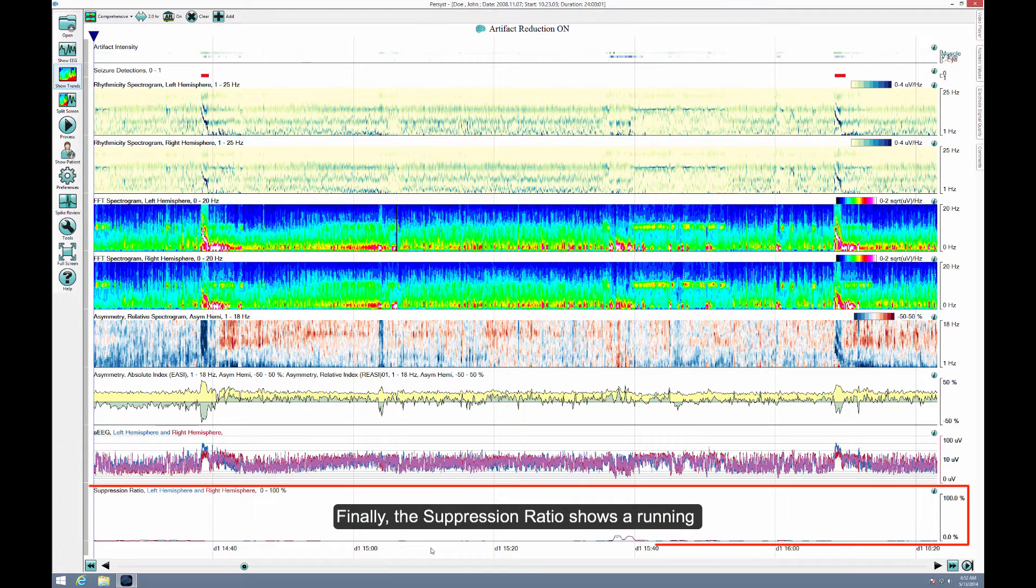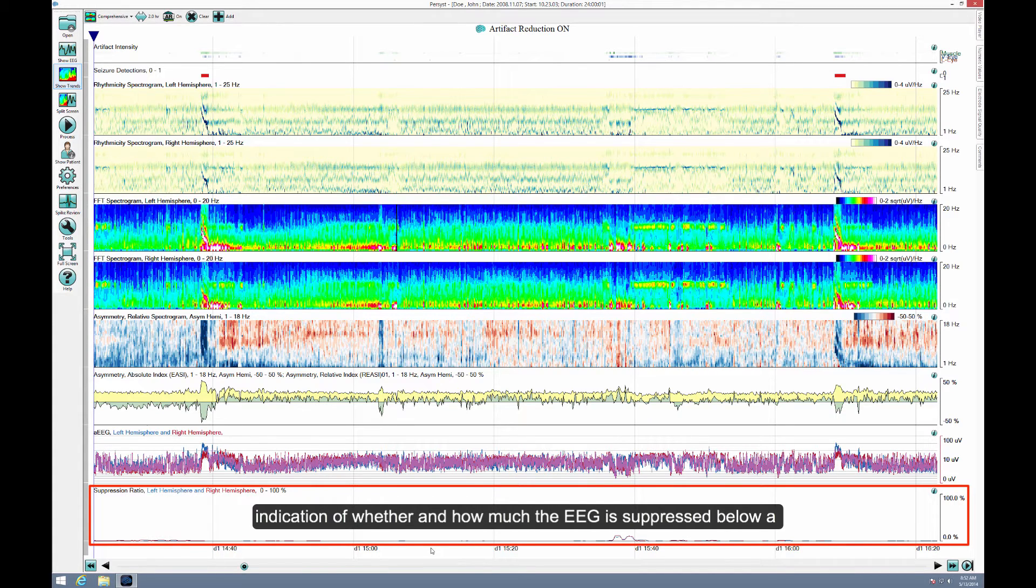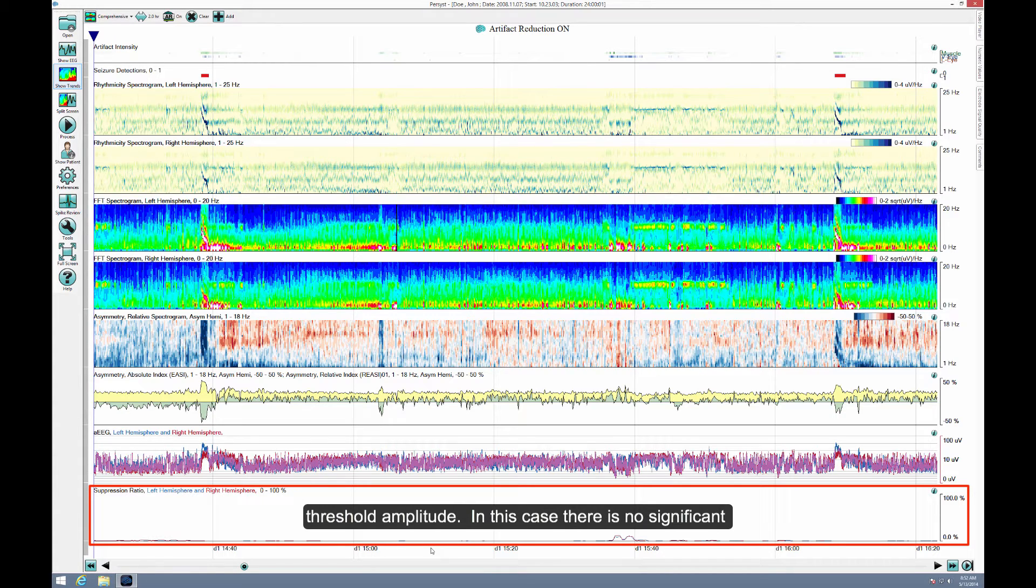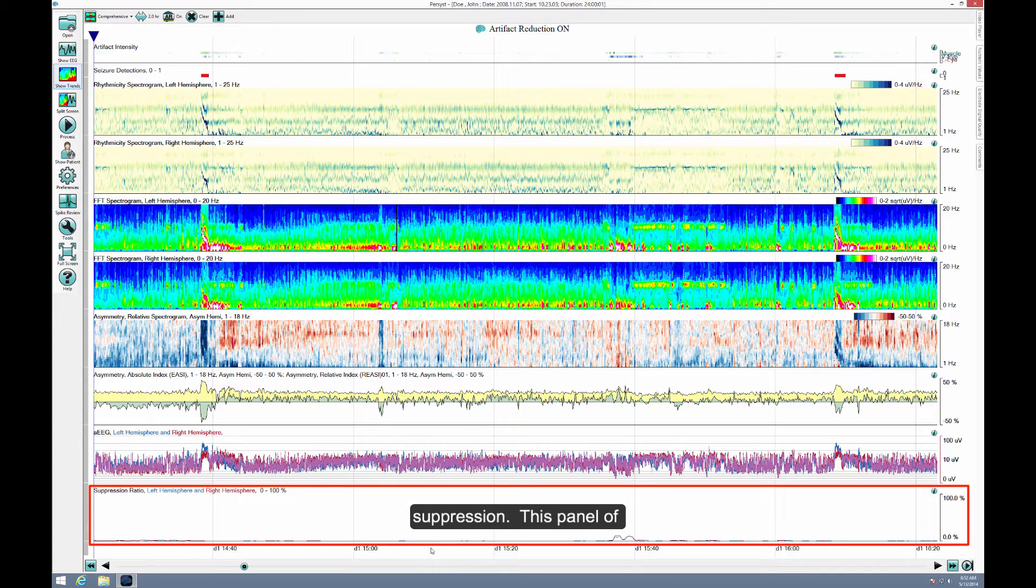Finally, the suppression ratio shows a running indication of whether and how much the EEG is suppressed below a threshold amplitude. In this case, there is no significant suppression.